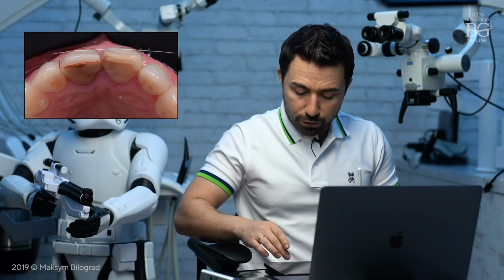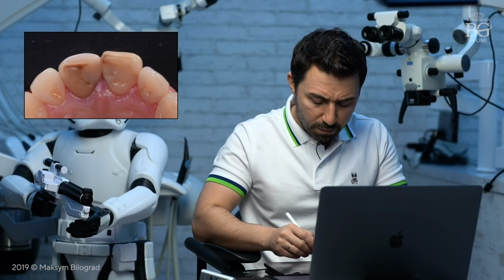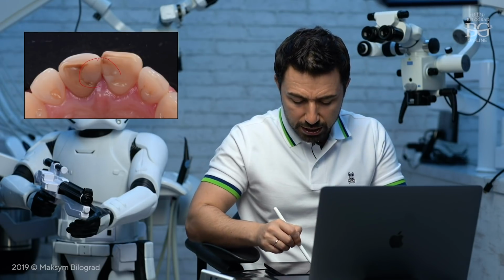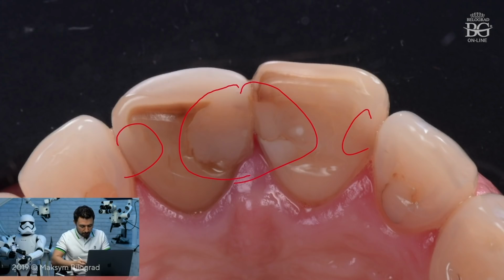Another picture which is also useful is a picture that you can take from the palatal sides. This picture will show you defects that may be visible from the palatal side. Take a look here. You have caries defects, you have some filling, etc. So this picture is good to have in your database and to show to your patient the real restorative status and the caries defects that your patient may not see from the palatal sides, because sometimes they just come and say, doctor, I have something on my buccal surface, I'm not happy with the color, or I have some white or black spot or whatever.